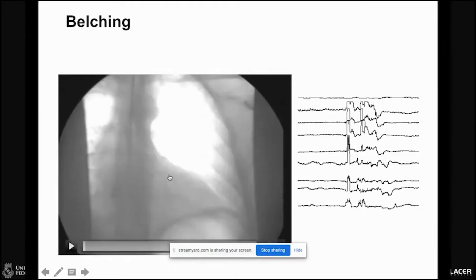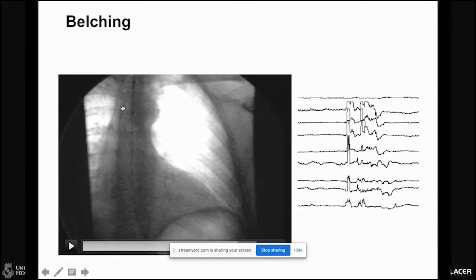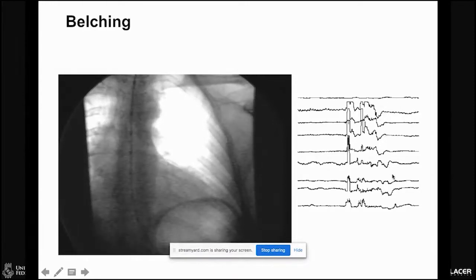And then there is a peristaltic sequence that is clearing the air. You will see it now. The tail of the bolus of air is moving, like Dr. Ghoshal explained to you earlier today, is a contraction here eliminating the air. And this is what we see here. This is an impedance volume clearance of liquid and air. So impedance can help us to evaluate movement of air.